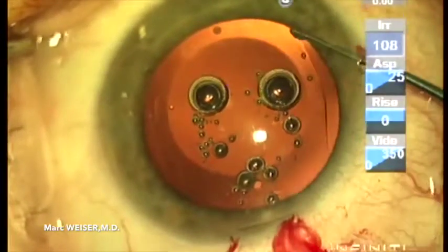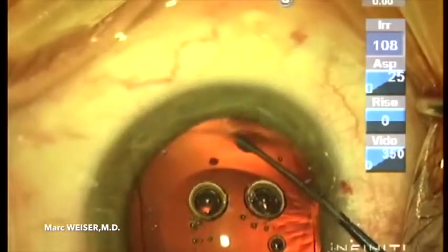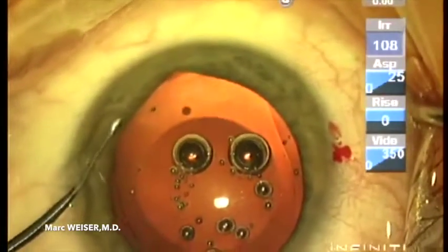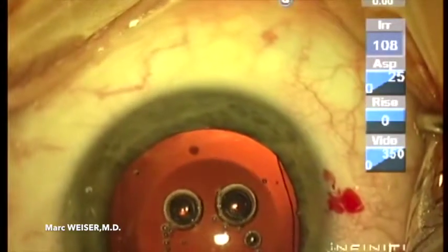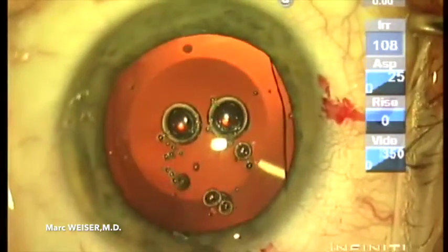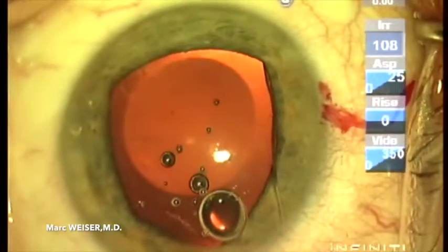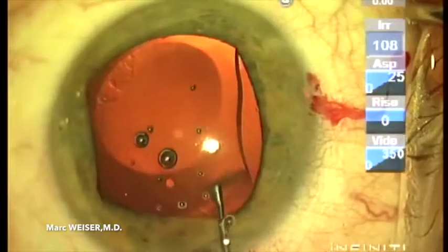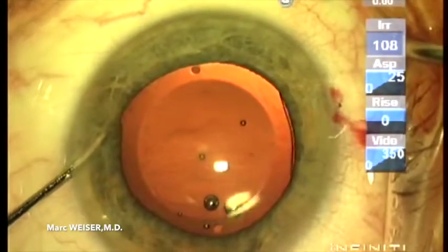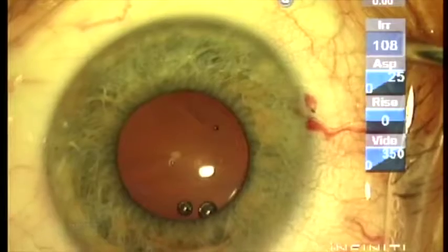The haptics of the ICL are placed underneath the iris. The pupil is constricted with a miotic substance. No sutures are needed for surgery.